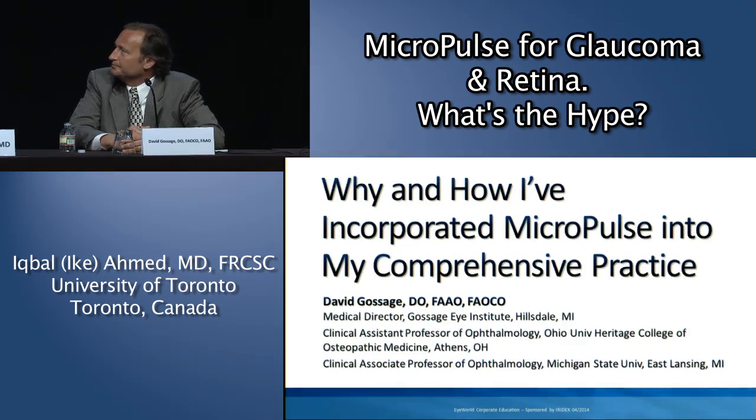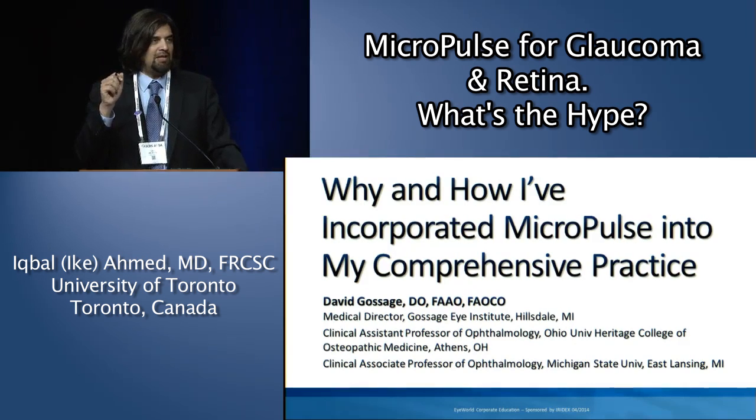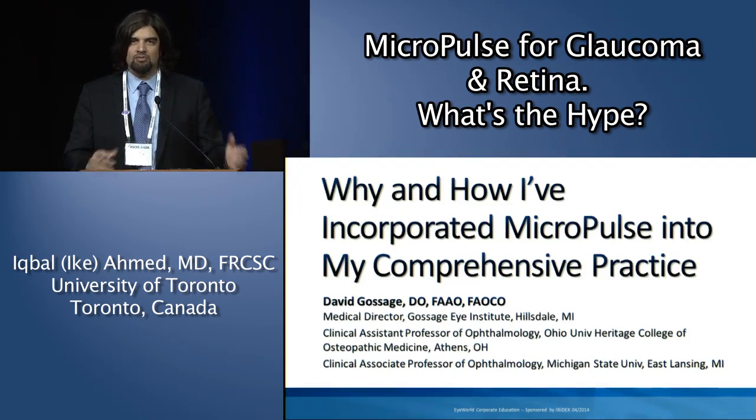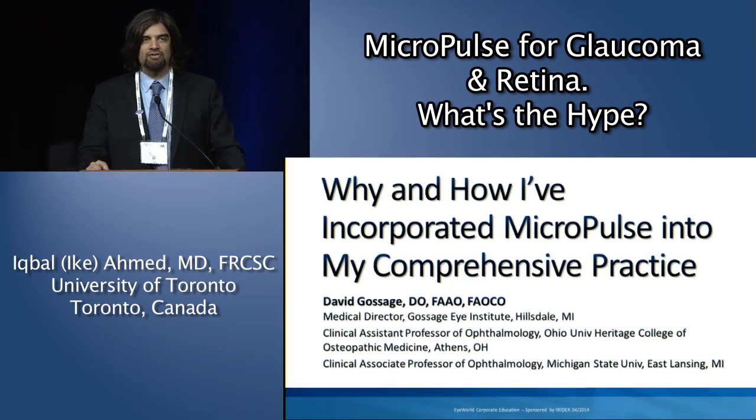Right. That's a good point. You're not going to see an endpoint when you laser. You're not going to see blanching. You're not going to see, as you saw in the video there, champagne bubbles. So that's sometimes a bit unnerving. Are you actually doing anything? Have a bit of faith, as we have, and I think you'll see the IOP results. So that's kind of a neat thing.